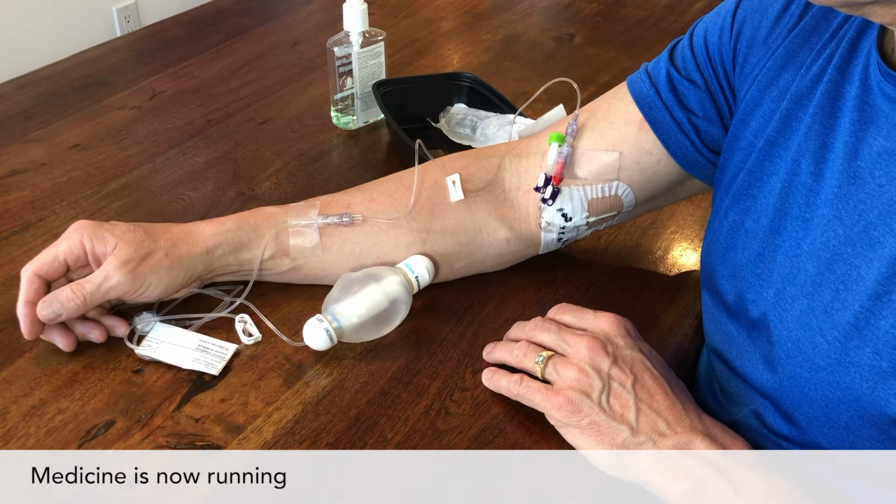You can secure the tubing in your IV sleeve if you have one, or tape it. If you use tape, make sure that you don't put the tape over the bandage or it'll be very hard to take off and could damage the bandage. Discard your supplies in the trash unless you were told otherwise by your healthcare provider. Wash your hands.